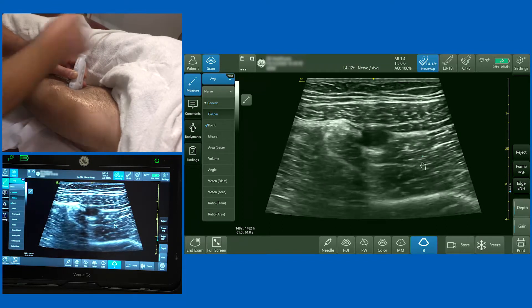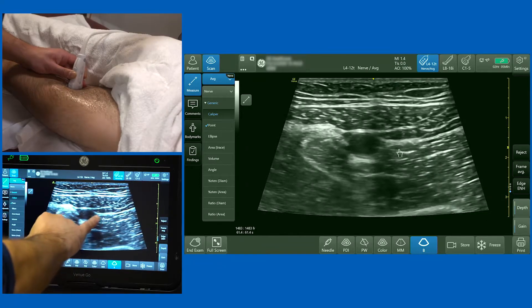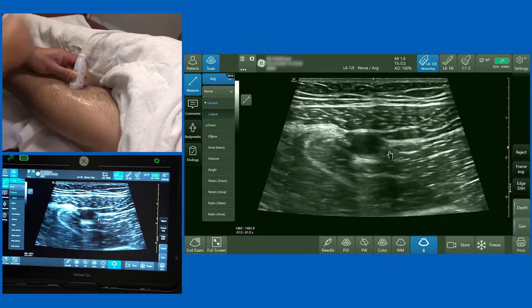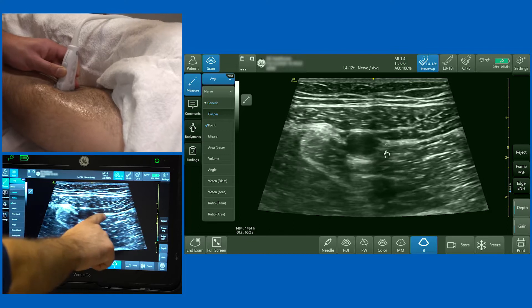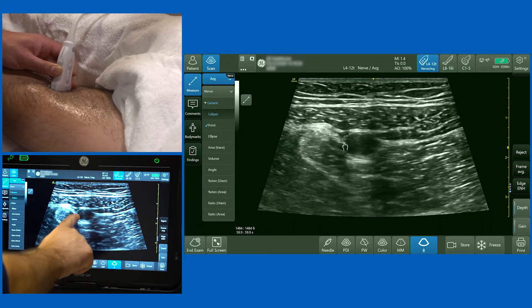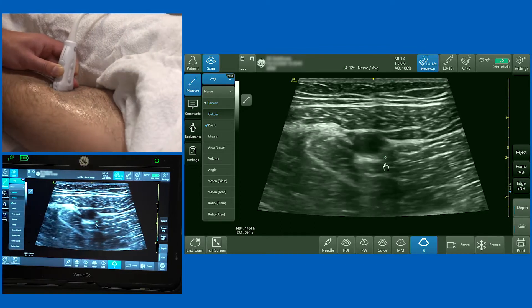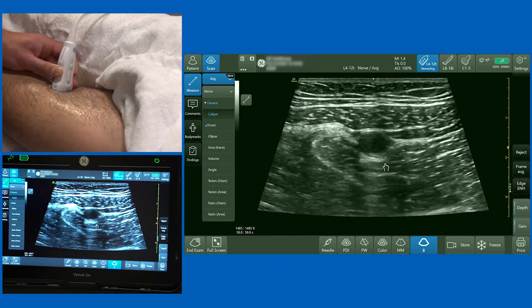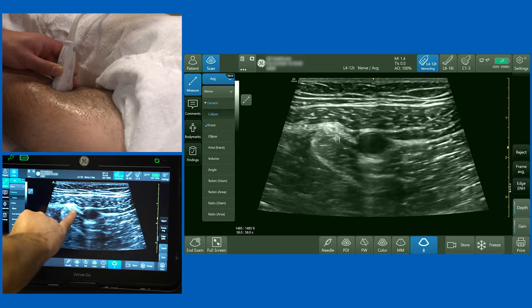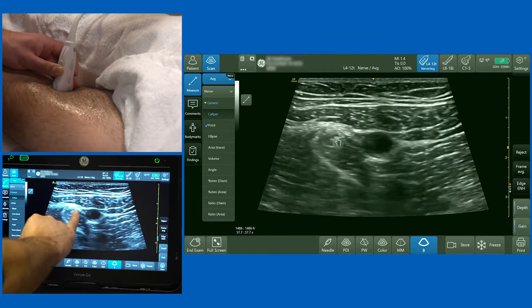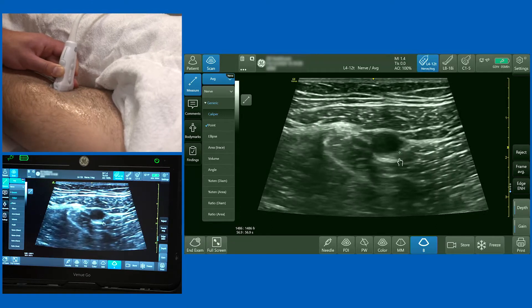Focusing in on the superficial femoral artery, I'll drop the depth a little bit and draw your attention to some bright white hyperechoic tissue over here. The aim of this block is to bring local anaesthetic from lateral to medial, be underneath the roof of sartorius, and inject local anaesthetic into this area to surround the artery. There's a vasoadductor membrane that lies above that structure, and you know you're in the right place because when you inject, you see the artery collapse down. In some circumstances there's a subsartorial plexus that lies on the medial aspect of the artery in this subsartorial tunnel.